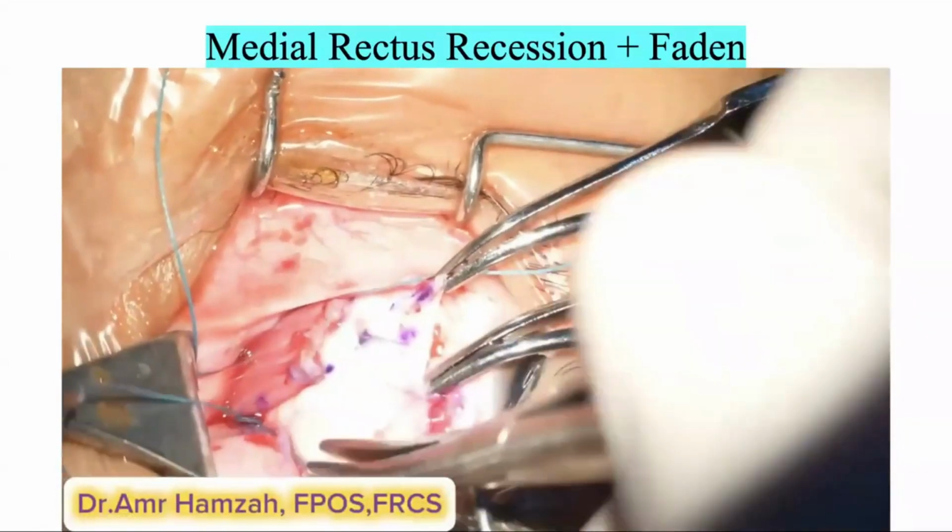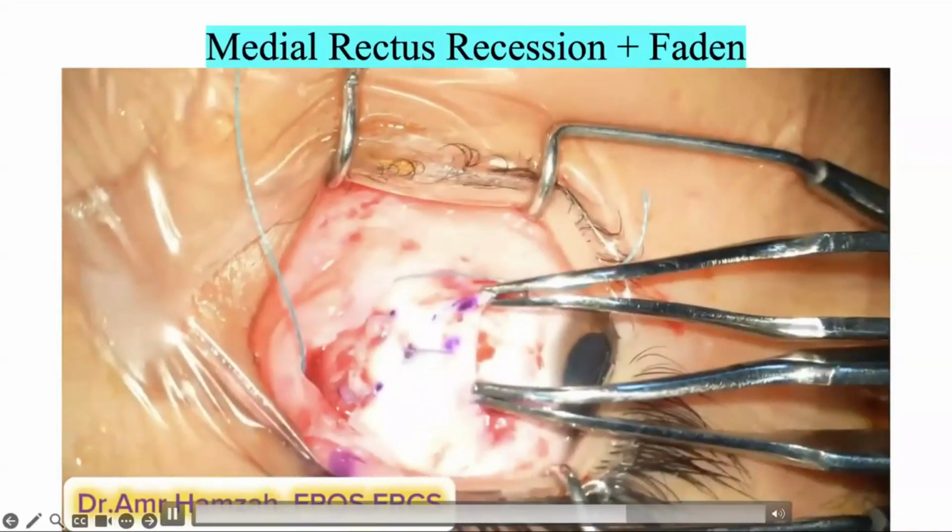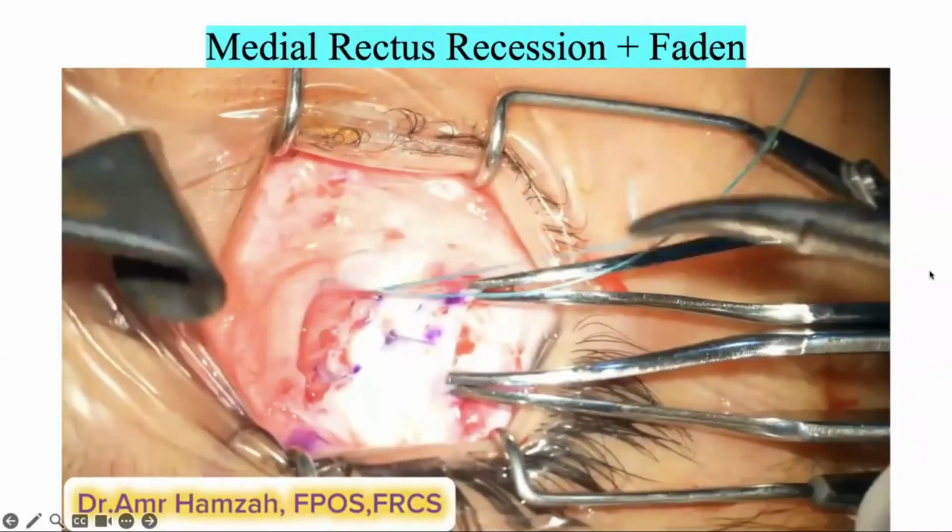Here, tying the Faden sutures and finalizing the surgery.